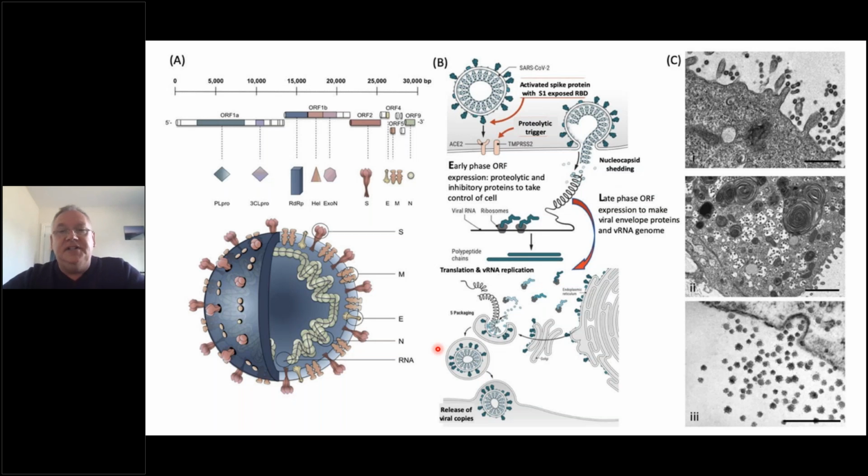So, MALDI-TOF, how can this come in and help be an adjuvant, a high throughput screening test that can support RT-PCR? Well, the first thing we've got to do is think about what our target is. And it's really about the physical biochemistry, the biology of the molecule. Something that Kathleen was saying, that you really have to look at the biomarker you're going to be looking for. Now, unlike bacteria, there are no housekeeping genes. There are no naked small proteins, which will be characteristic, that we've seen in a lot of the previous talks.